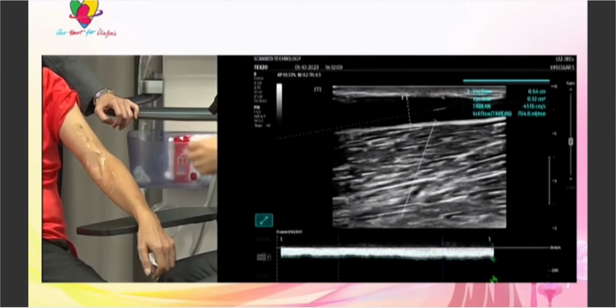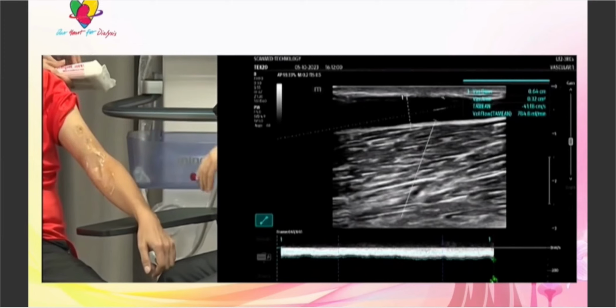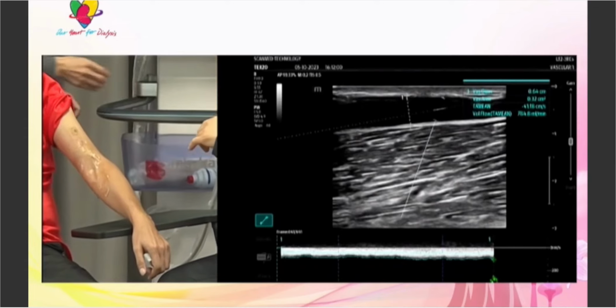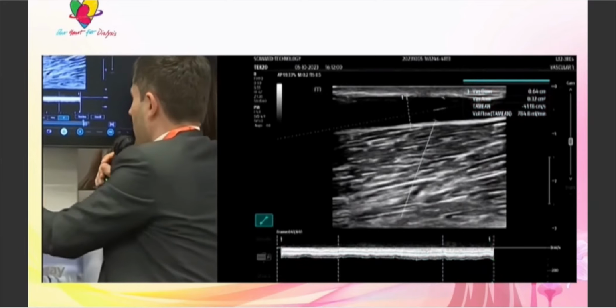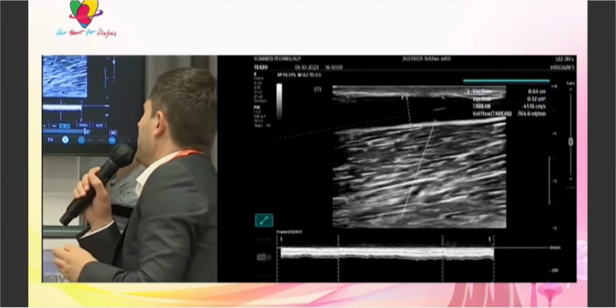There are probably 100 to 200 in his arterial system and a couple of hundreds in the deep venous system, somewhere lost. We cannot measure it, as a difference to surgical. So all of the patients I had with dual outflow, with good basilic and good median cubital, had a high flow, because he's kind of a high flow, right? 1,800 would be considered in some, especially in Asian countries, as a high flow. So yeah.